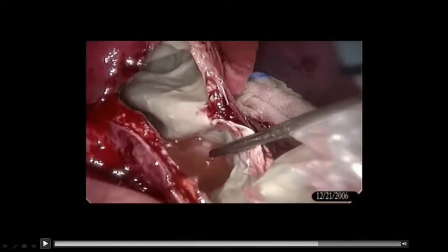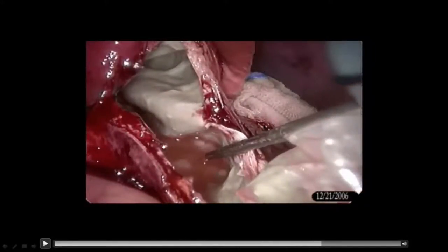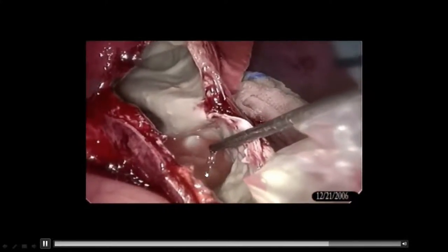Again here, before sucking, you should instill the hypertonic saline and wait for a few minutes. And after that you should suck it out, so that all the parasites will be killed and there is no chance of re-implantation.